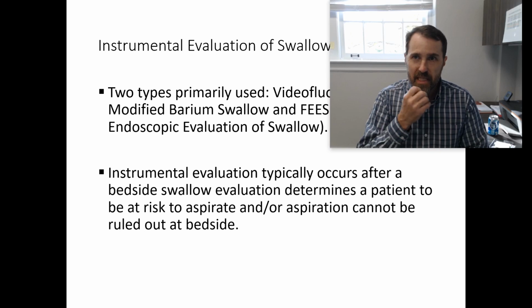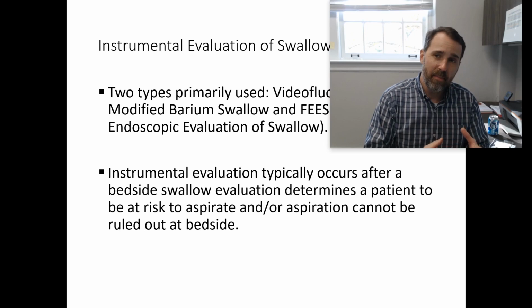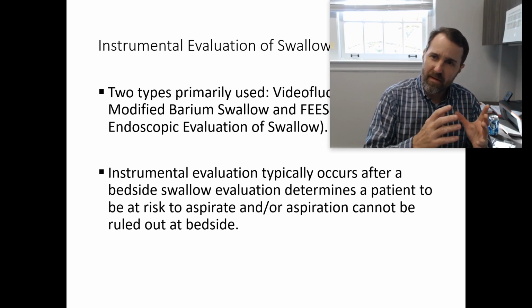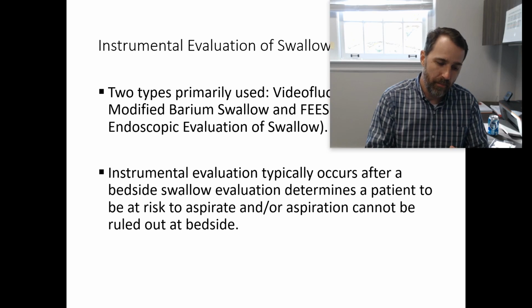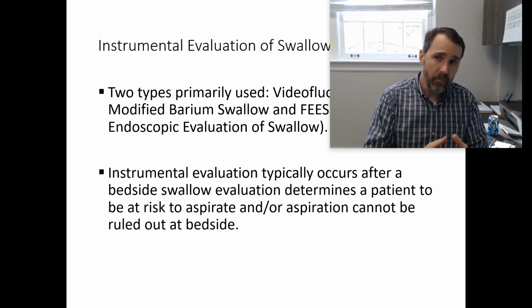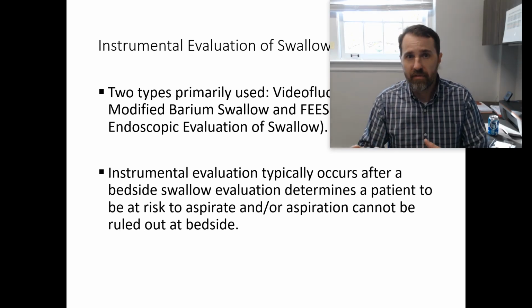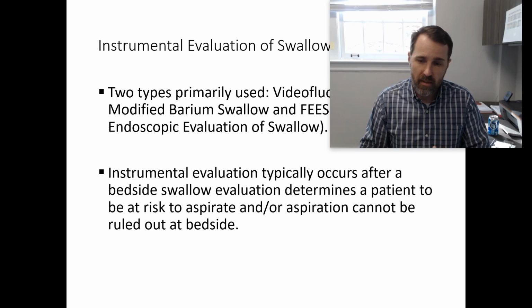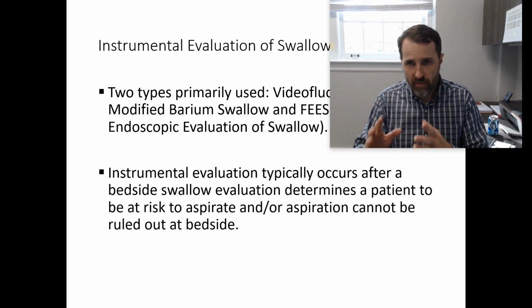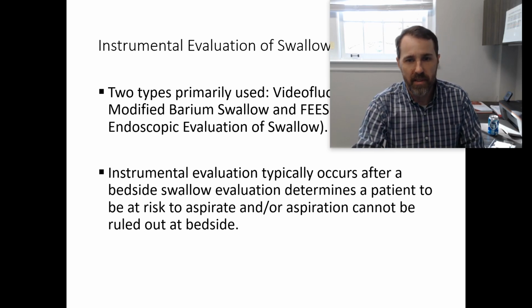Usually what happens is more often than not, you will have seen the patient and will have done a bedside evaluation, detected that there may be a problem or that there is a problem, and you have referred that patient for a modified or a FEES to confirm that there is a problem and to tease out exactly what that problem is.